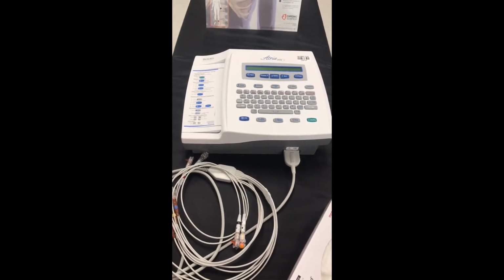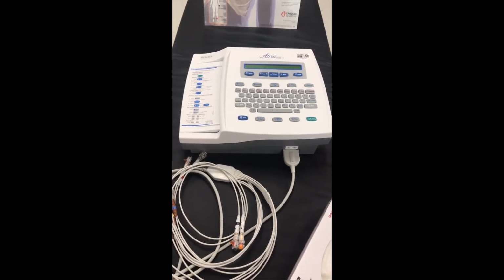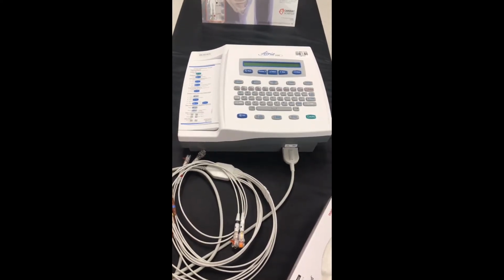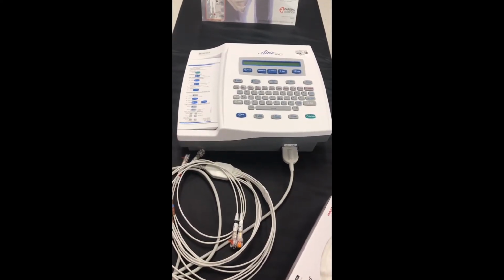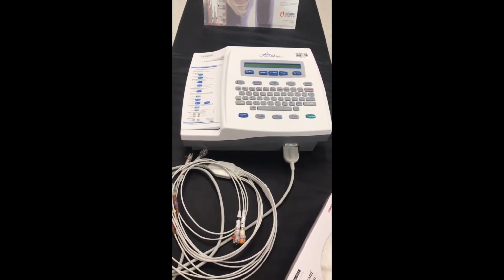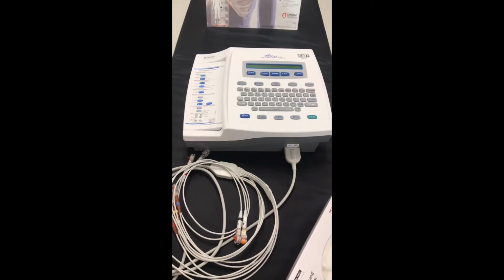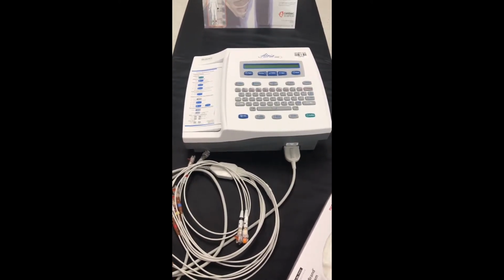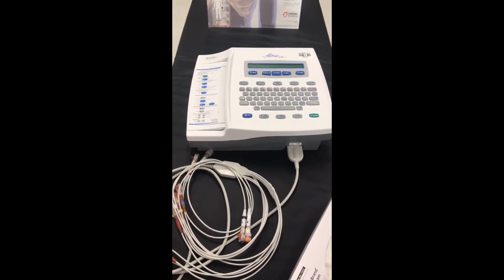At this time, we can introduce ourselves to the patient and properly explain the procedure to the patient. Reassure the patient that this procedure will not hurt. Provide the patient with privacy and make sure the patient is comfortable with the procedure. The patient may have to be exposed slightly. Now we can enter the proper patient identifiers into the ECG machine, as per facility policy.